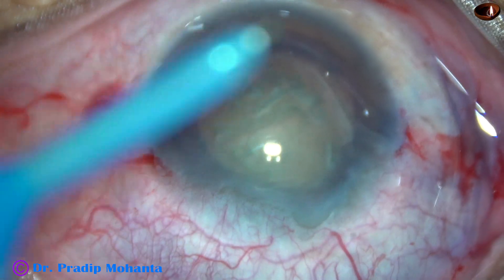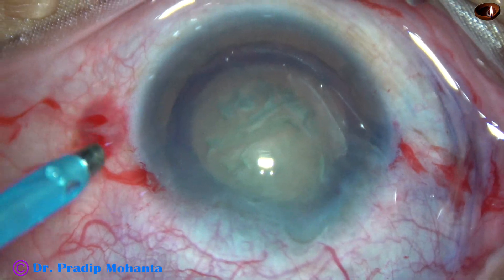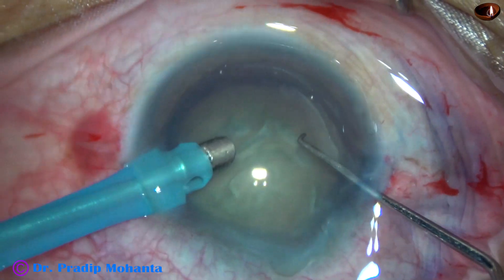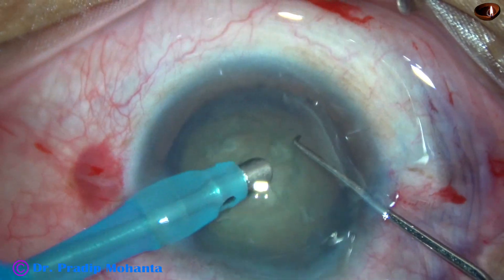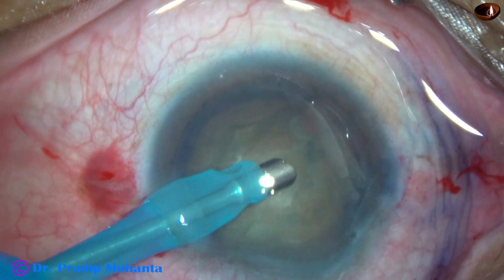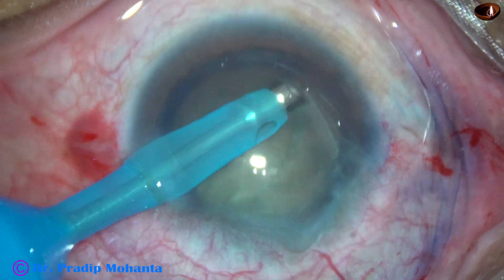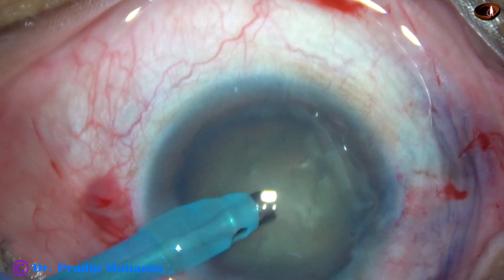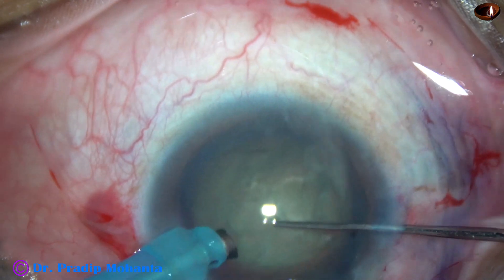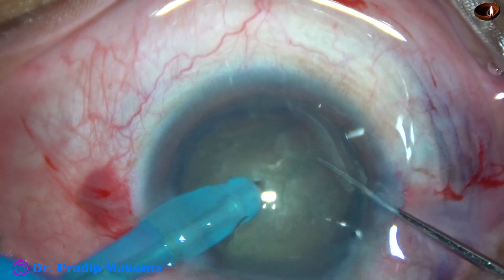Now inject viscoelastic again. The handpiece is held with my non-dominant left hand and is being introduced into the anterior chamber. I aspirate some superficial lens matter, cortex, and epinucleus for better visibility. Then I turn the handpiece with the help of my right hand, hold it properly with my left hand, and I am going to divide this nucleus into pieces. I go into the substance of the nucleus.